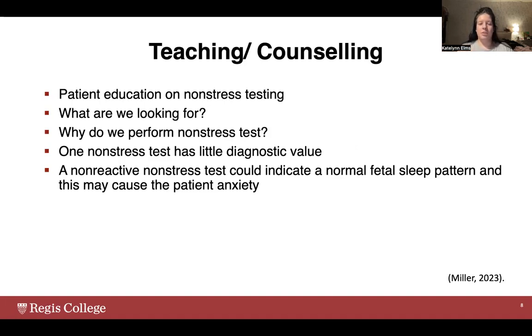Some patients do get frustrated with this, especially when I worked on high risk, like with people whose water broke early with PPROM, they'd be there for a few months at a time. So they're getting these tests sometimes 2 and 3 times every day for months. Some of them get really interested in it, and I really enjoy teaching patients how to interpret it so they know what's going on. People are a lot more amenable and agreeable if they understand why we do what we do.